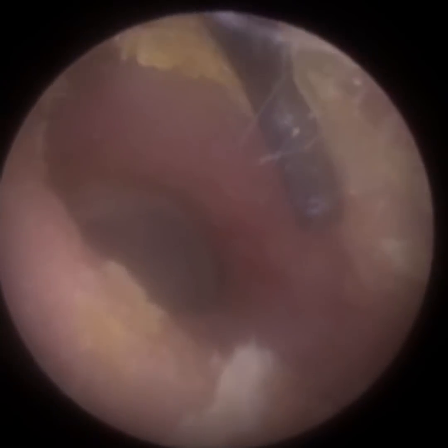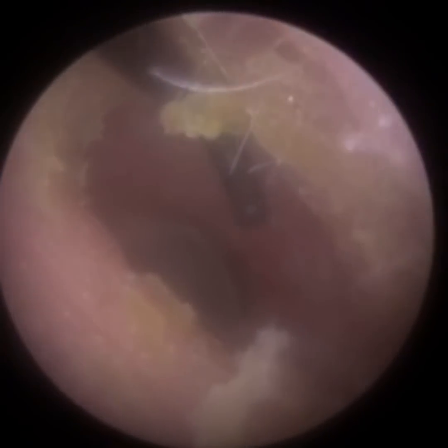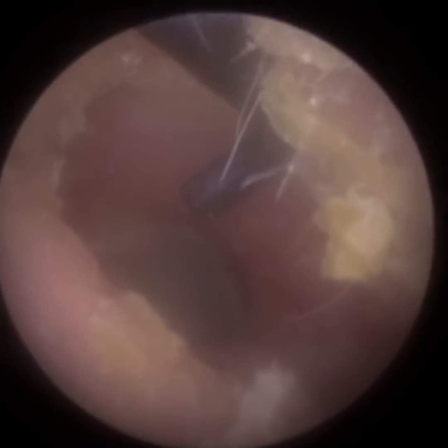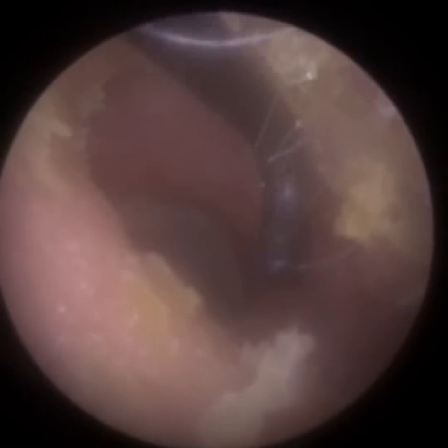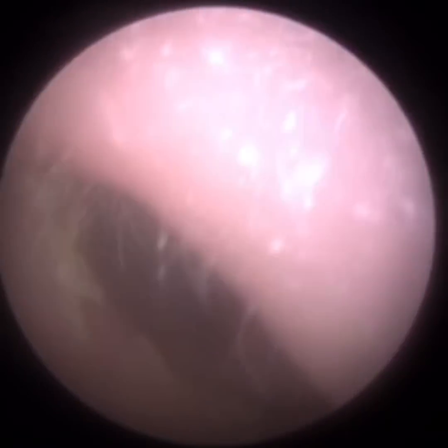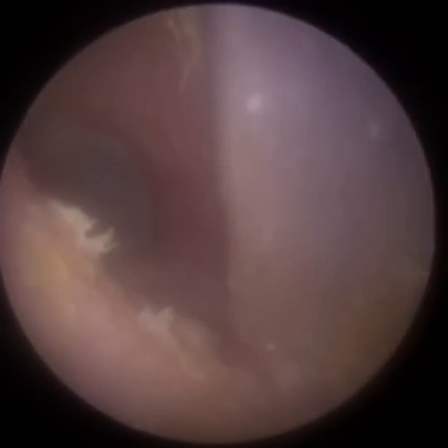I've removed that plug — the eardrum's nice and healthy, visible in the distance. I'm now just using the hook — not the pointed bit, but the edge of the hook where the 90-degree bend is — to almost chisel out this wax on the cartilaginous portion to remove it. There's some dry skin there, so I'm going back with the suction to help with that.